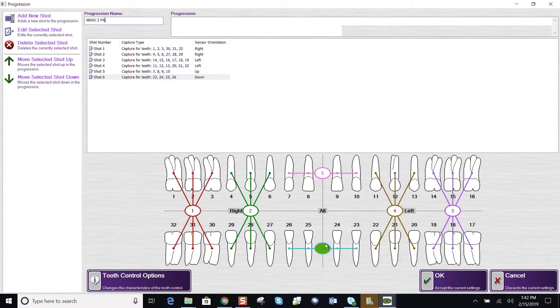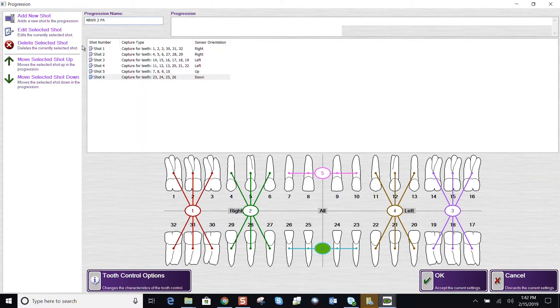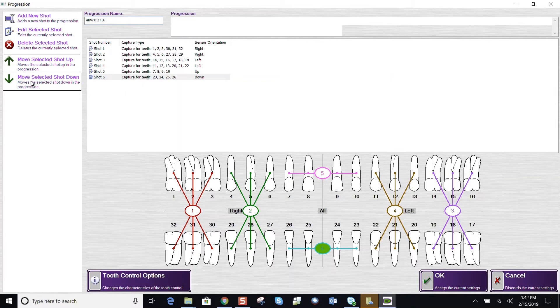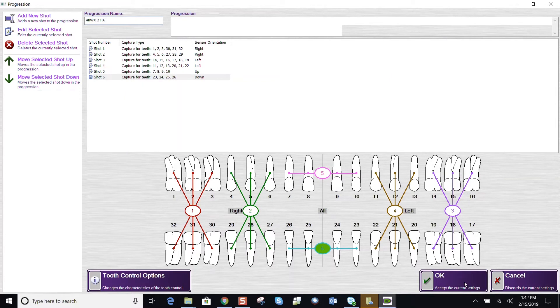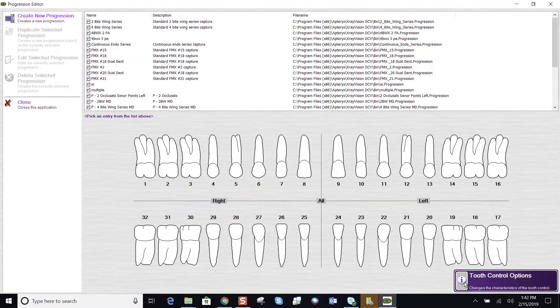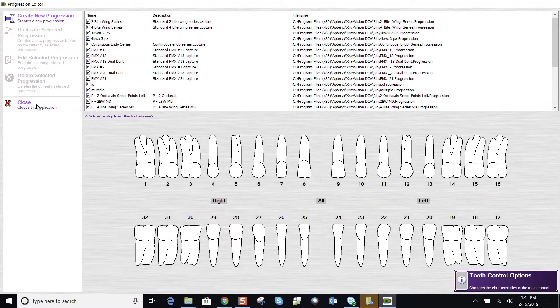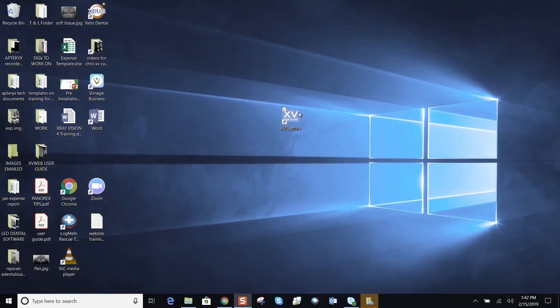If we need to edit those shots, we can highlight the shot and edit and move these shots up and down if we need to rearrange the order. When I'm finished, I'm going to say OK. And now I can close this application and close down.